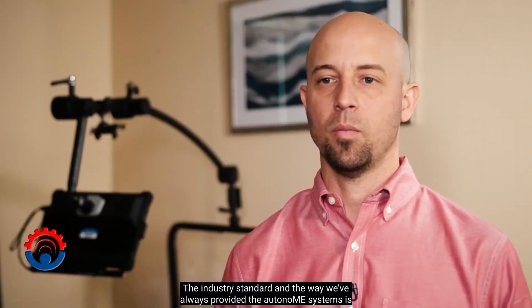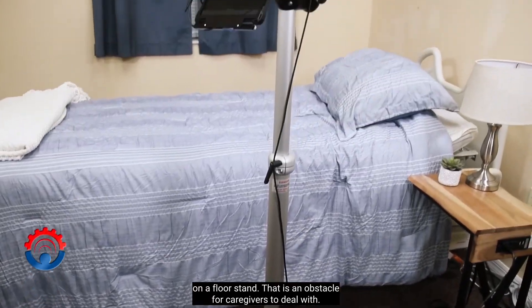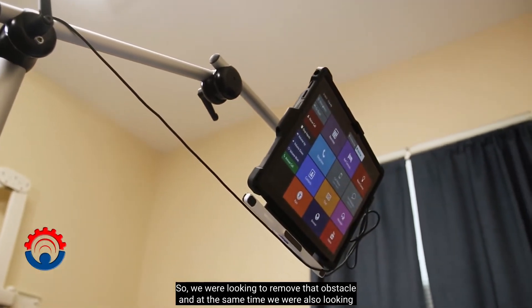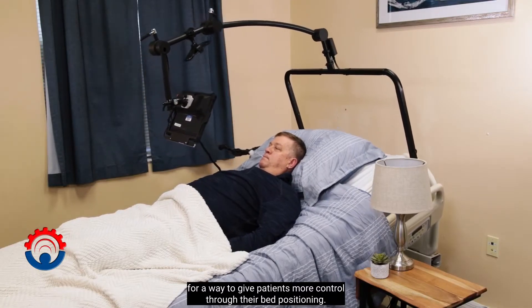The industry standard — and the way we've always provided the autonoME systems — is on a floor stand. That is an obstacle for caregivers to deal with. They have to physically walk around or move it out of their way. So we were looking to remove that obstacle, and at the same time we were also looking for a way to give patients more control through their bed positioning.